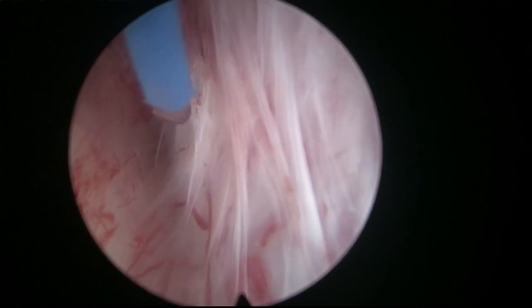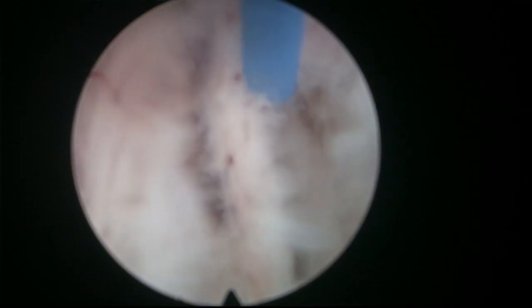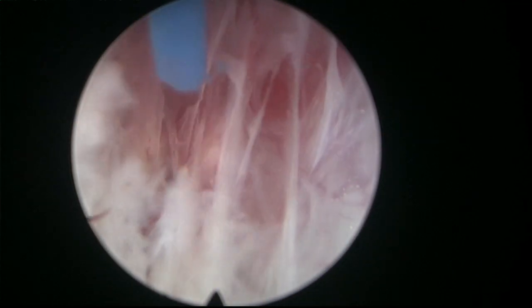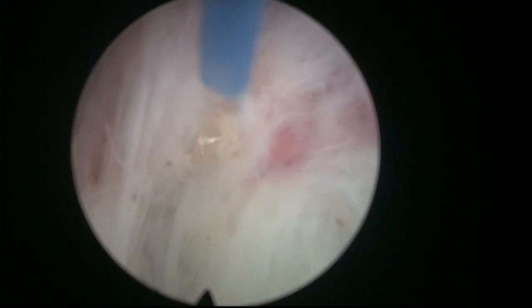So if we develop the bladder neck a little bit more and we cut the bladder neck, we will have to look inside and see where the UOs are. That's a good suggestion. It tells me that you're understanding the procedure very well.